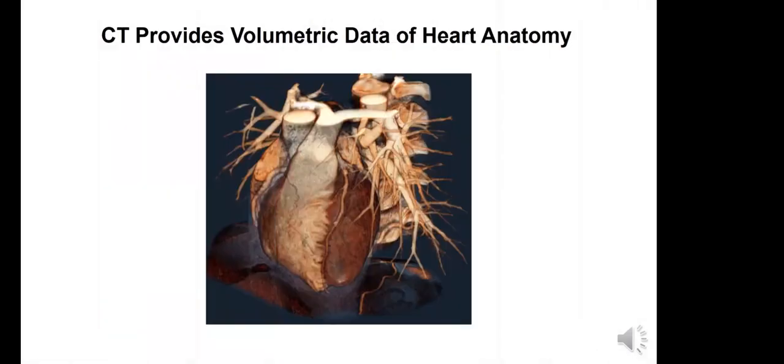One of the advantages of CT imaging is that it provides three-dimensional volumetric imaging of the heart and surrounding structures, especially when contrast is used with opacification of cardiovascular structures.